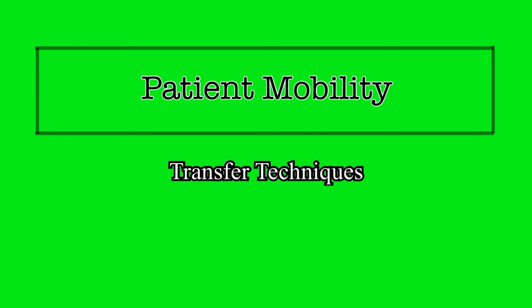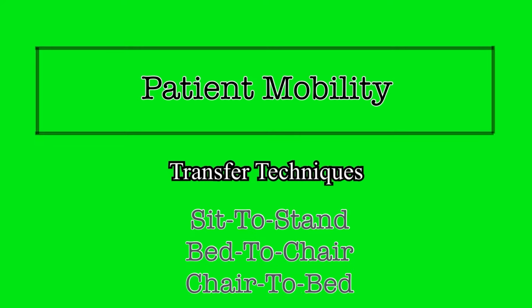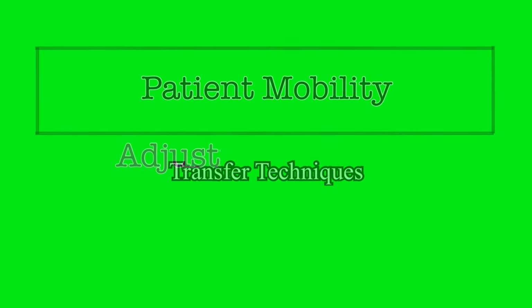As with the variety of techniques needed to mobilize in the bed, there are many ways to help a patient mobilize out of the bed. This video will demonstrate how to help a patient stand to a walker, transfer with a walker from bed to chair and chair to bed, and how to transfer a patient from bed to chair and chair to bed that cannot use a walker but does require assistance. Depending on the patient's abilities, all of these techniques can be performed with either one or two-person assistance, and that will be showcased in this video.